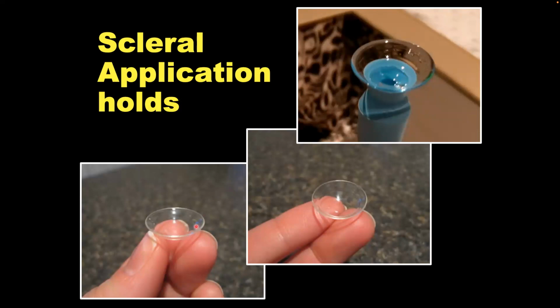There's another way to apply the lens with the tripod method or two fingers. This is the more unstable way to put the lens in, but we can always show them. I would do this with a 14.8, not with a 16.3. But just having the plunger is most of the time the solution for inserting the scleral lens, right?